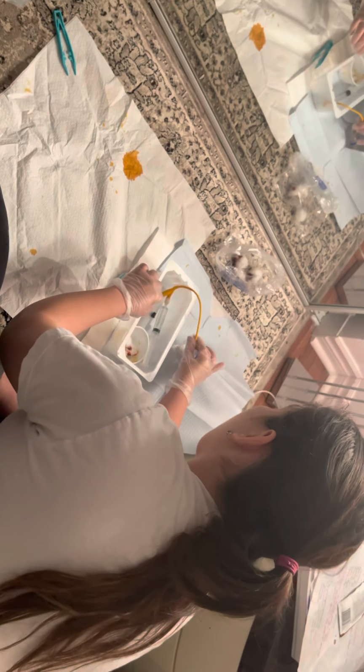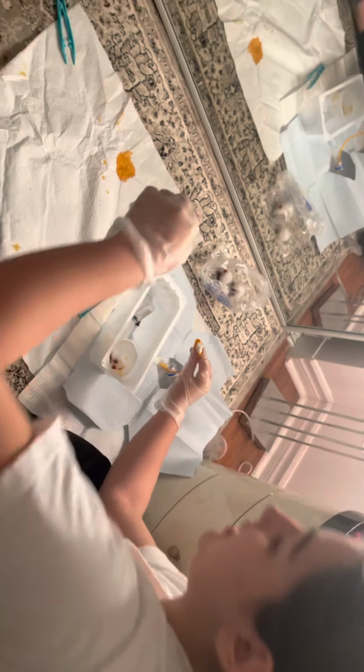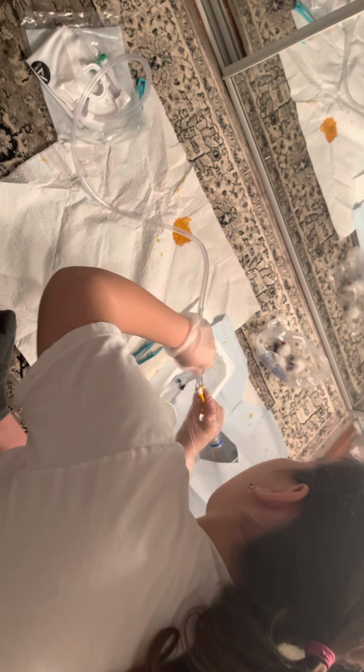Once I've done that, I'm going to release the labia with my non-dominant hand and place my non-dominant hand on the catheter as I begin inflating the balloon at about 5 cc's. So once I've inflated the balloon, I'm going to pull a bit to check for resistance, to see that the balloon has been properly inflated. I'm going to release the inflation syringe. And I'm going to take my drainage system and insert it into the catheter.